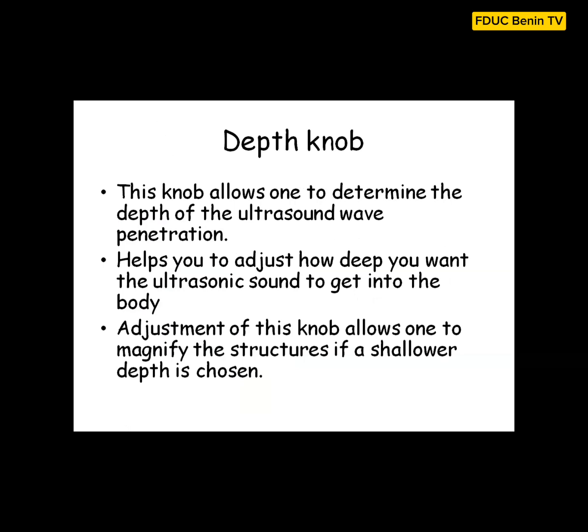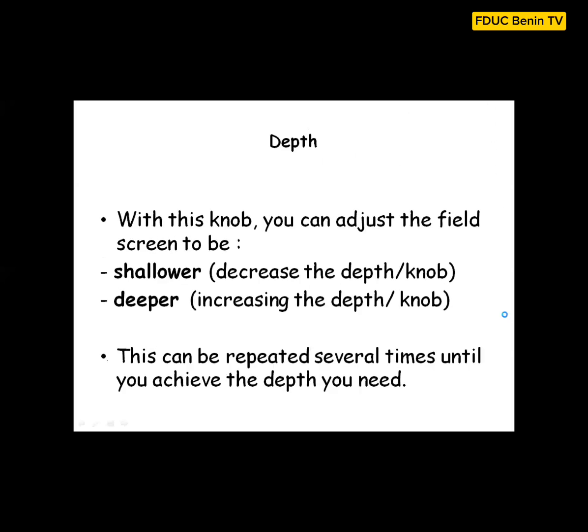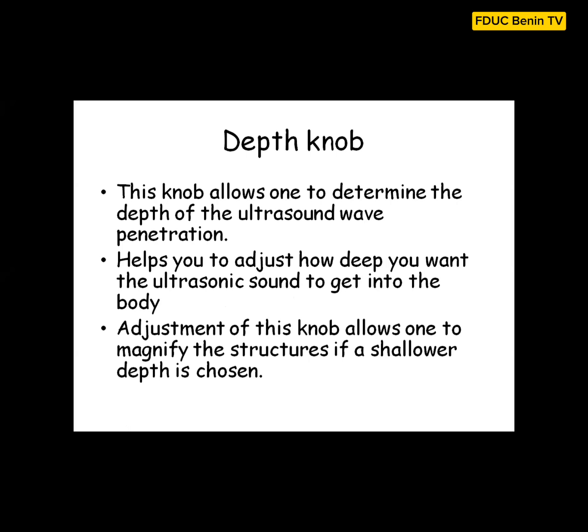So this knob helps you to magnify structures. You choose your depth. As you start to scan, you can increase the depth, or as you go along, you can reduce the depth. And as you do that, as I said earlier, if you look at the screen, the monitor, you will see that you are either increasing or reducing the depth.